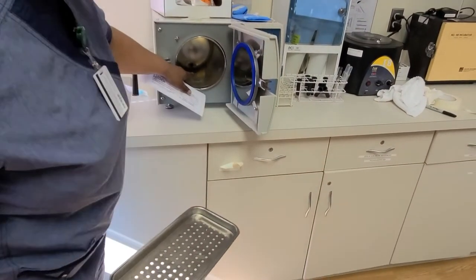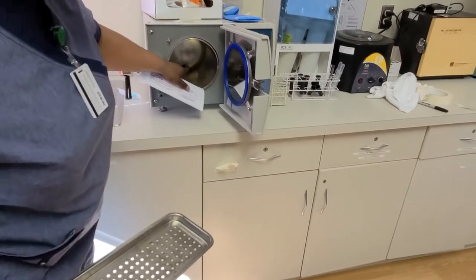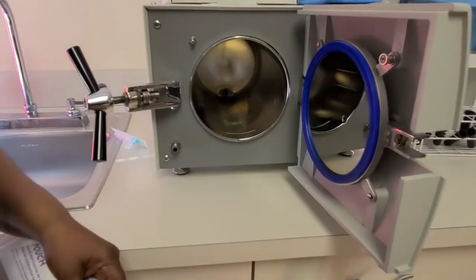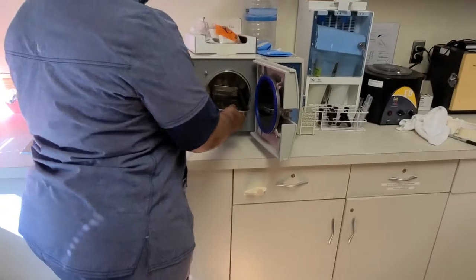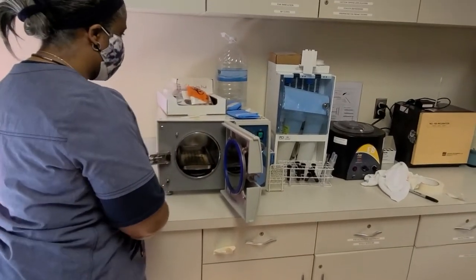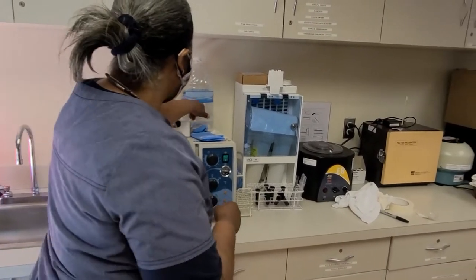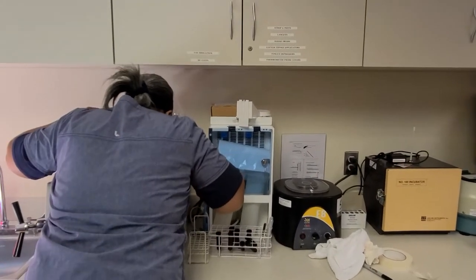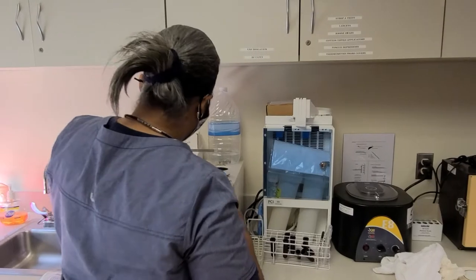But I have a reservoir here. I don't know if you can see it. There's a reservoir and it has water. Okay. And so I'm not going to put my instruments in here yet. I'm going to go through the process. Alright, so what I would do is this. I am going to first check my reservoir down here. And I can see I'm very low on water.